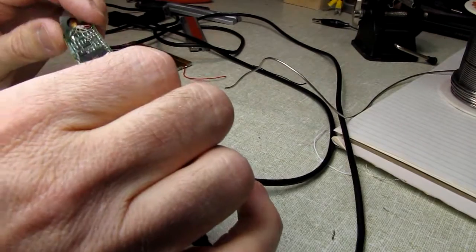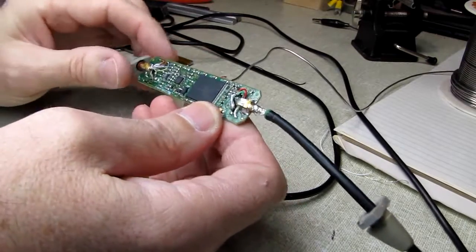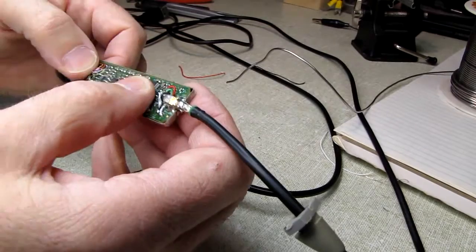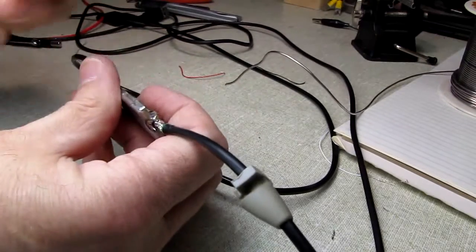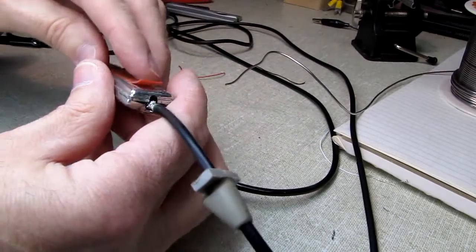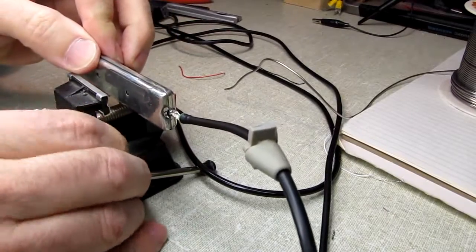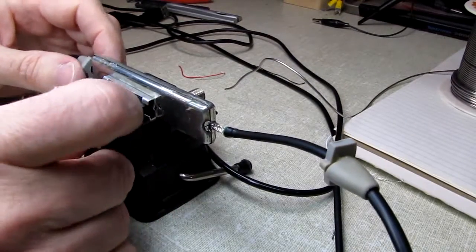And that looks pretty solid. We'll bring the case over here. Let's see, we've got an on and off switch here, so that's got to go on this piece. So that drops in there. Then we'll put the top cover back on, and I don't think this had any left or right or up or down. And let's see, we'll try matching up. Yeah, we can't even match up. There's not much solder there, so we'll slip this puppy back over the top. And we'll bring my handy dandy little Radio Shack vise back over here, just to hold all the works together while we have at it with the slobbering iron.